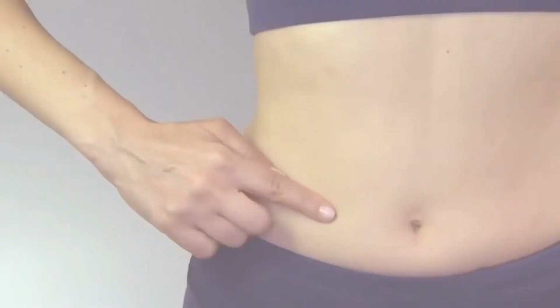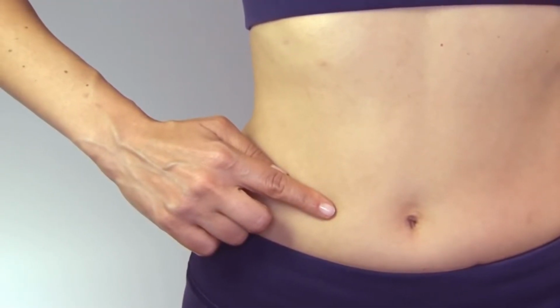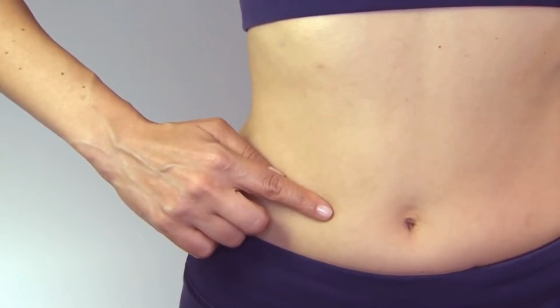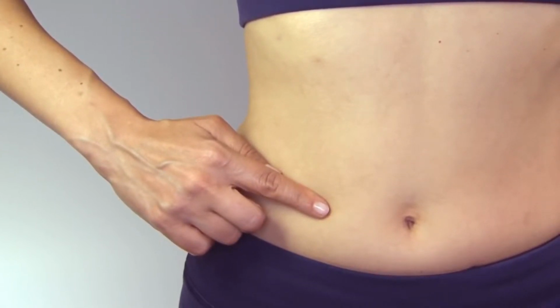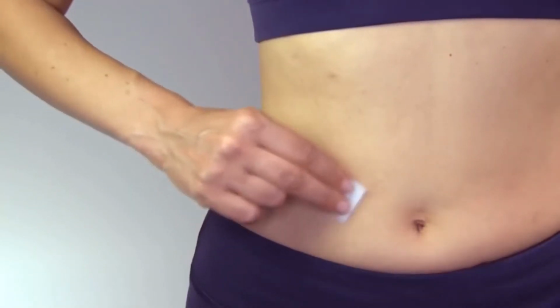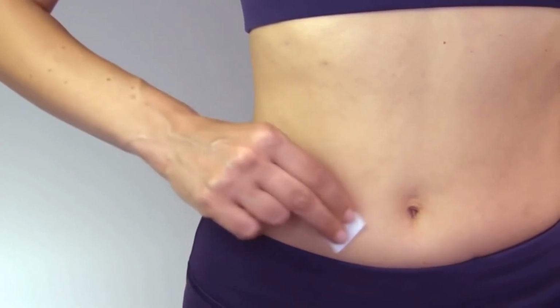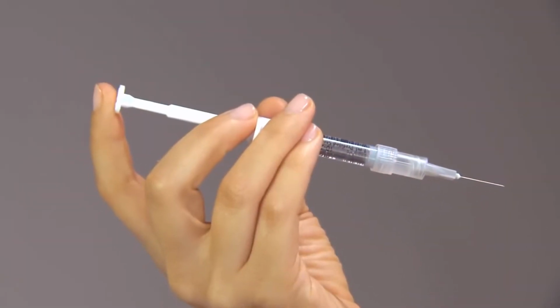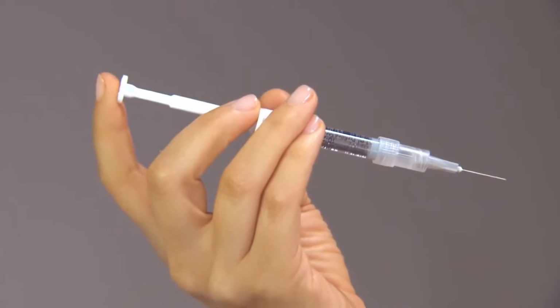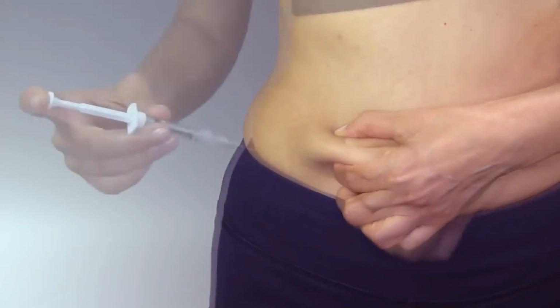Step 3. Inject. Choose an injection site in the lower abdominal area, preferably around the belly button, but at least 1 inch away. Choose a different injection site each day to minimize local irritation. Take an alcohol wipe and clean the skin at the injection site and allow it to air dry. Hold the syringe with one hand the way you would hold a pencil. Pinch the skin on the chosen injection site with the other hand.